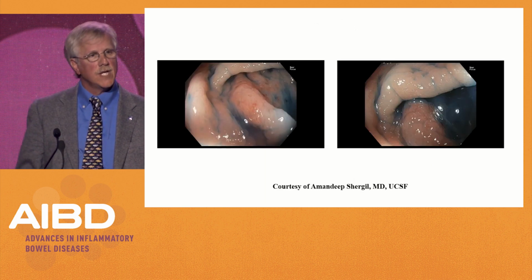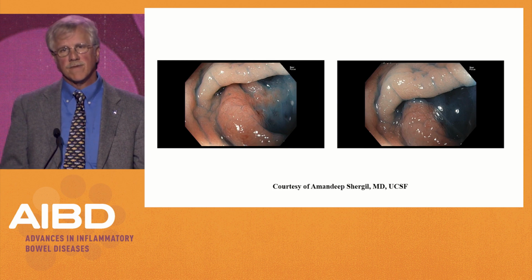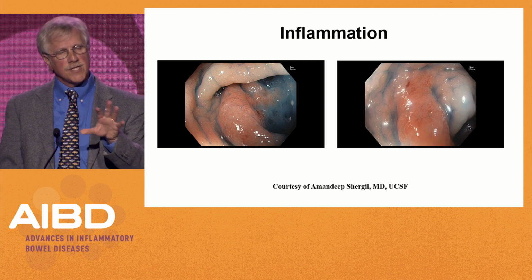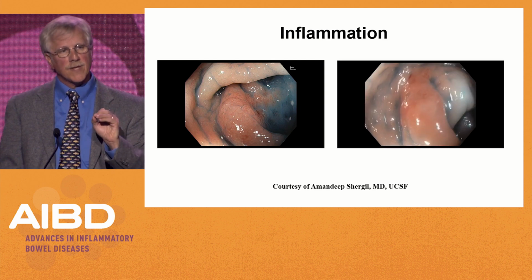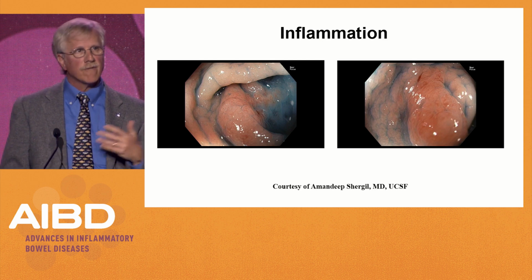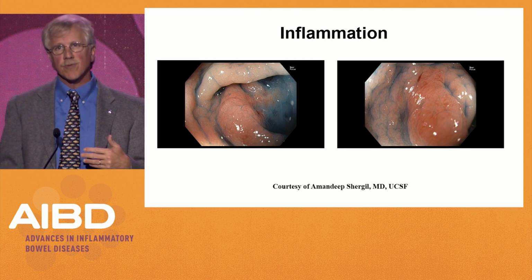Next slide, please. So let's run some videos. I'll click again. So this is a patient. You can see that there's a discoloration. You have to remember that there are two dyes, methylene blue or indigo carmine. There are various shortages at any number of times. We've been using the methylene blue.